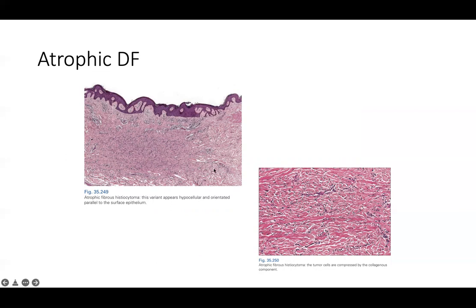And so you can appreciate the collagen trapping. There are so many other histologic aspects to this that make you think of a fibrohistiocytoma. You've got thick collagen bundles in between the proliferative cells. You could do a CD34 and a factor 13A on this, but given the architecture of this and the collagen trapping, I would favor this to be dermatofibroma. Calling it atrophic would just be based on the clinical, as well as if you do see atrophy of the dermis surrounding it, et cetera.